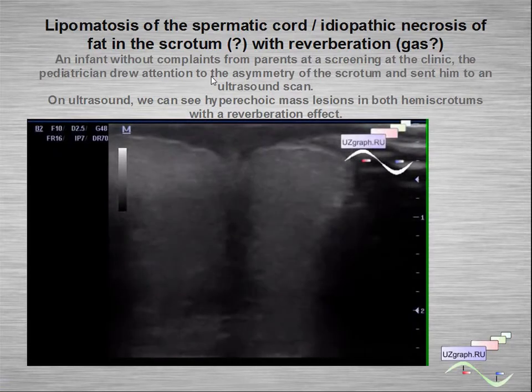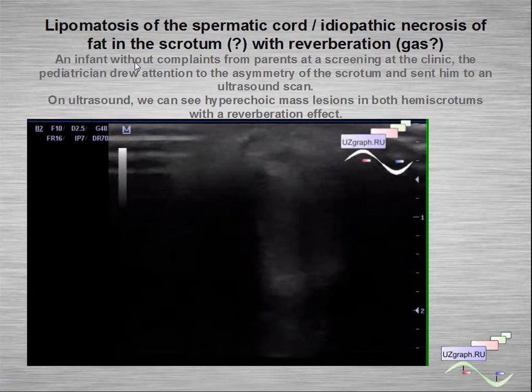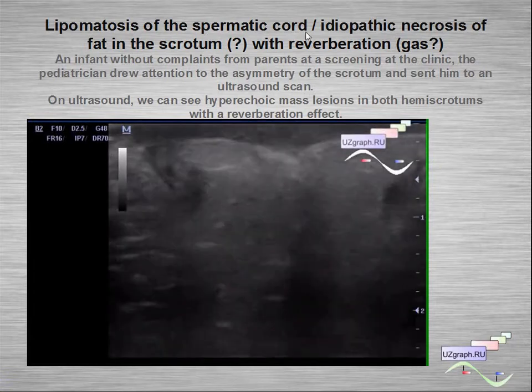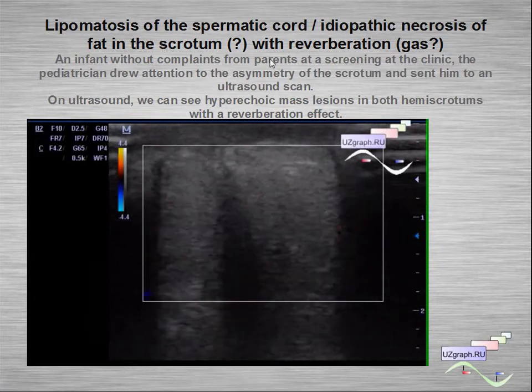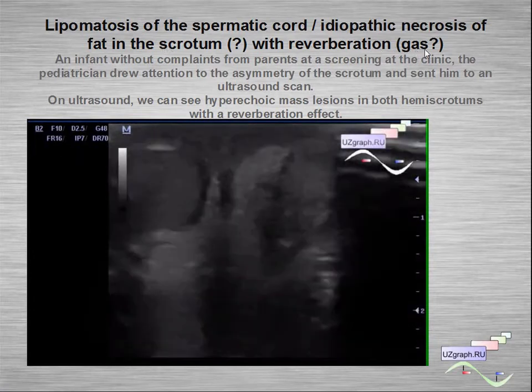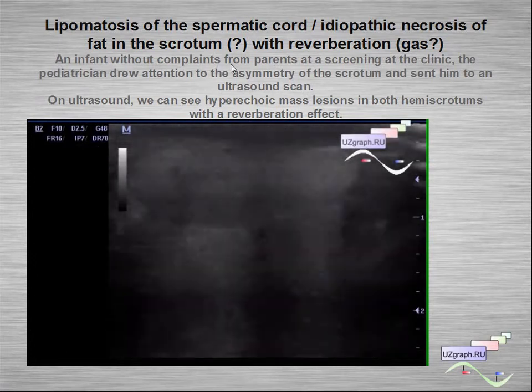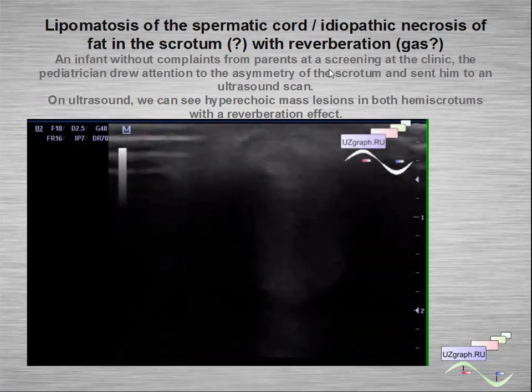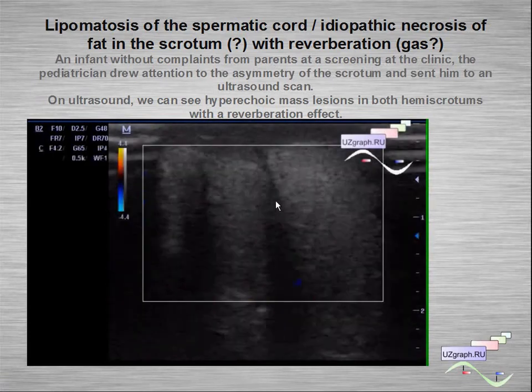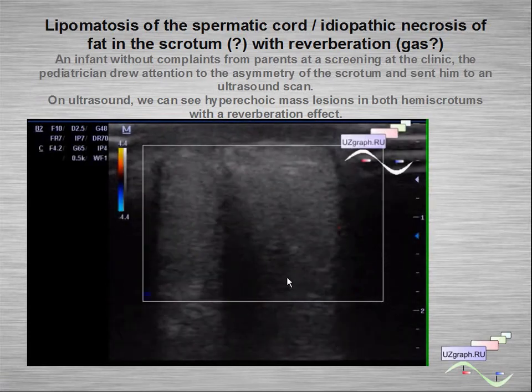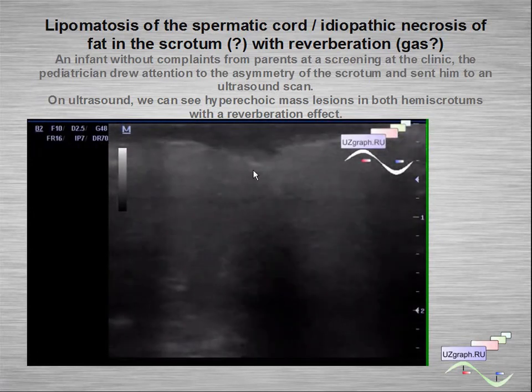In another case, this is a rare case of lipomatosis of the spermatic cord with idiopathic necrosis of fat, with a reverberation artifact resembling gas. This is an infant without any complaints on screening. On ultrasound we can see a hypoechoic mass lesion in both sides of the scrotum.